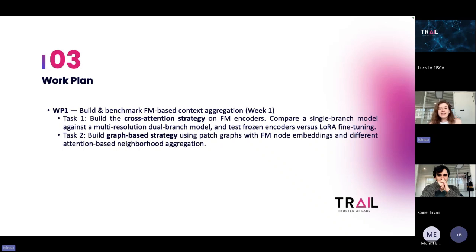Let's keep in mind that what we want is more like a clean benchmarking of these strategies on the publicly available TCGA cohort. So even negative results will be very useful since no one before has systematically compared these approaches for TLS segmentation. And if time allows, we will also look into fine-tuning some of these foundation models using, for instance, a LoRA approach.